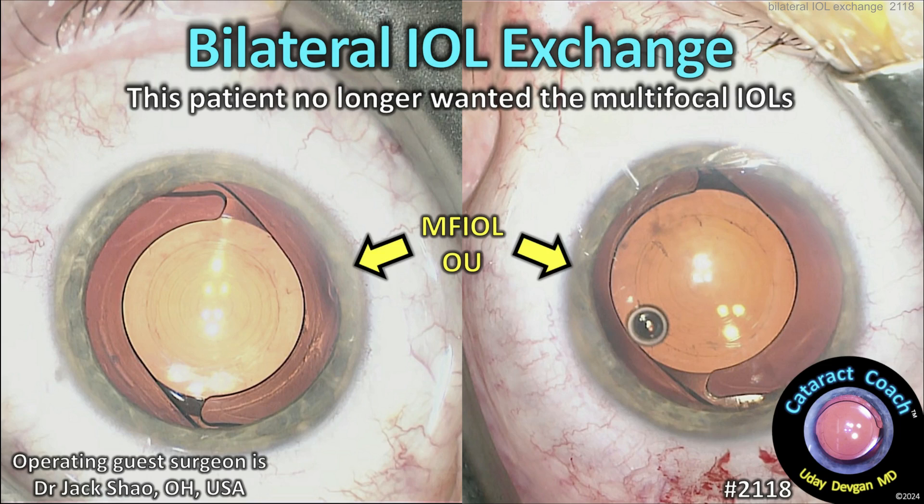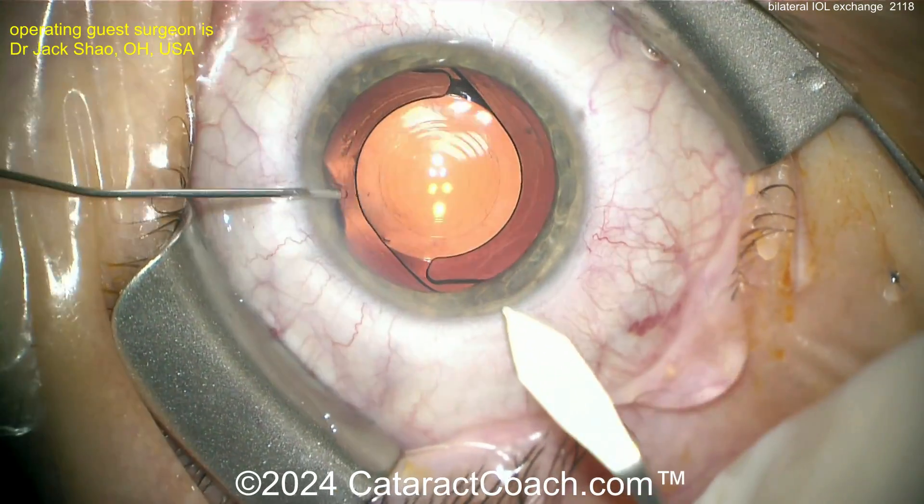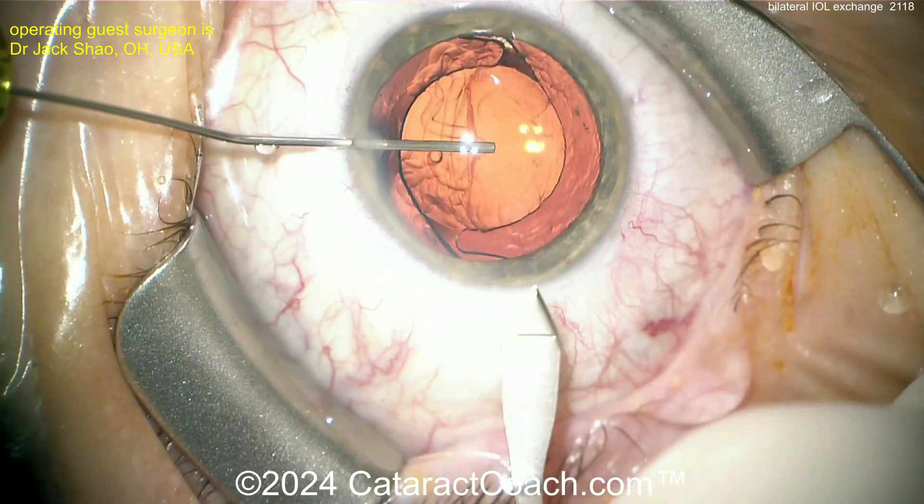This is a cataractcoach.com bilateral IOL exchange case. This patient no longer wanted their multifocal IOLs. Bilateral — and probably not same-day bilateral — but here's the patient.